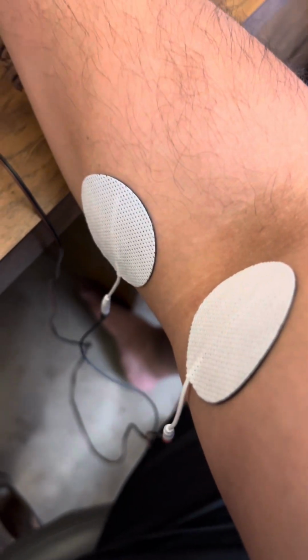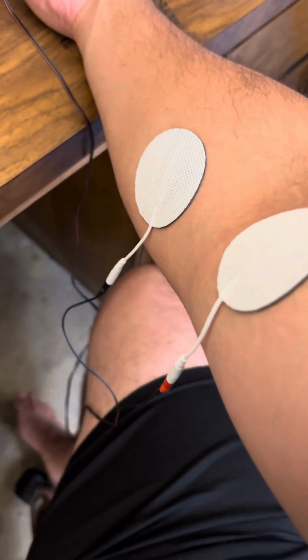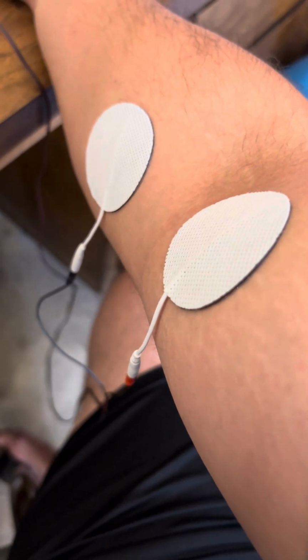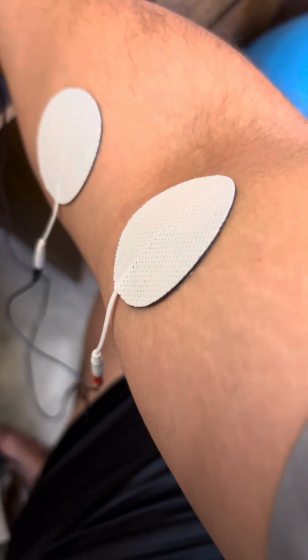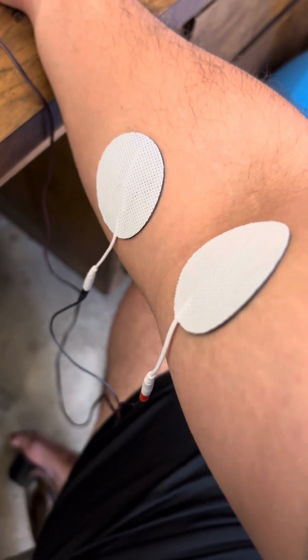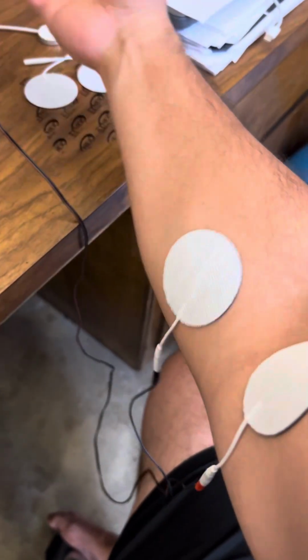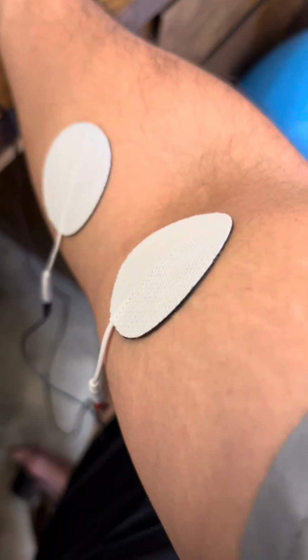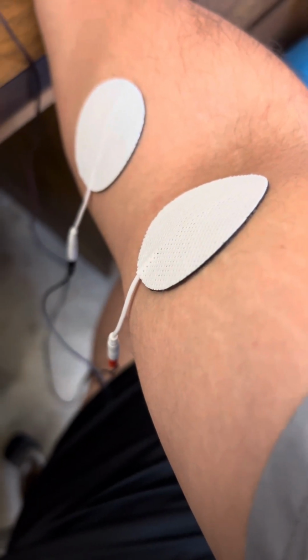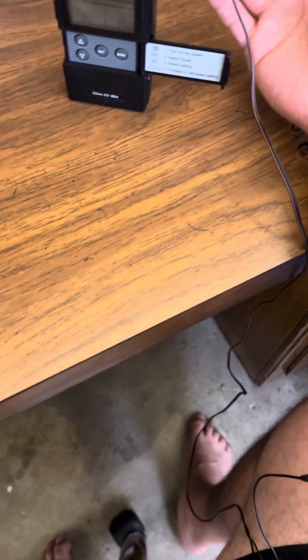And the good thing about this one is that you get to control the amplitude, so the intensity, based on the patient, right? And again, it should be more of a tingly sensation than anything. So there shouldn't be like a muscle twitch, right? It shouldn't be doing this, right? It's more of a tingly sensation. I like to say more of a staticky sensation. And they get to control it, right?